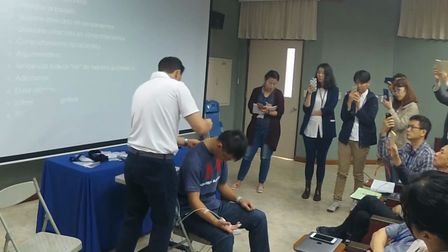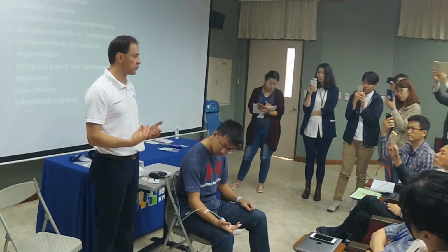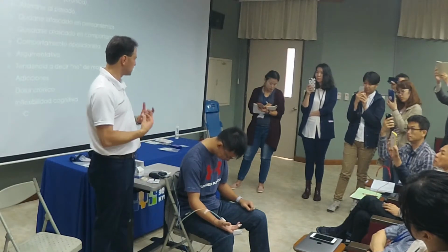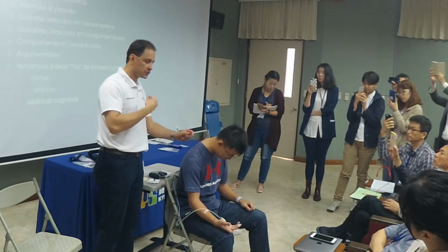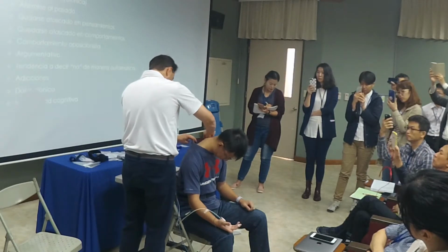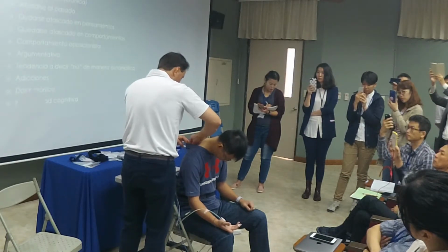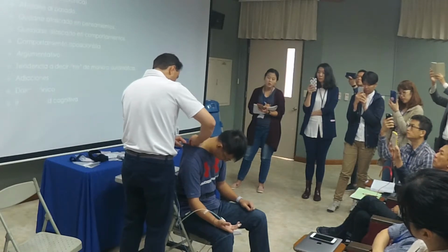Now, I use the word sensor as opposed to electrode because I don't want people to think I'm going to electrocute them. Some clients might get anxious. If I say electrode, that means there's going to be electricity involved. So I say sensor because it's sensing the area. But some colleagues are really particular about that and they get upset if you don't say it right. So I choose sensors.